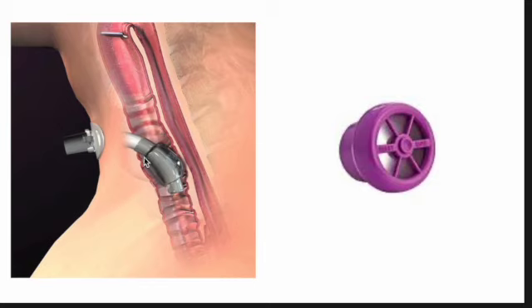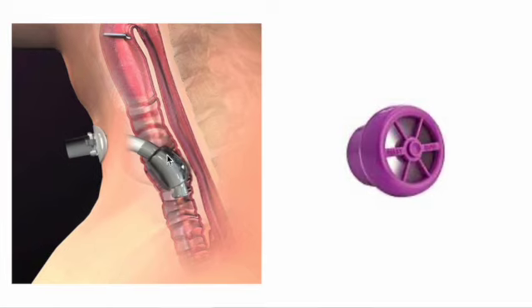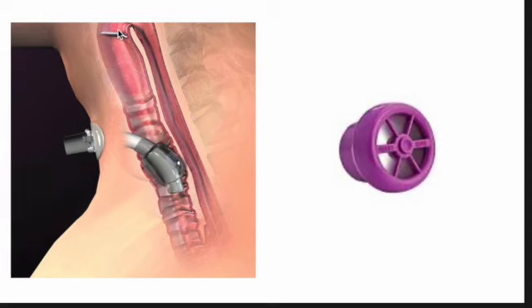What if a patient with a tracheostomy tube wants to speak? Should this balloon be inflated or deflated? Yeah, it should be deflated so that the air goes up and engages the vocal cords. So imagine that you're rounding on a patient with a tracheostomy tube, and you go to talk to them, and they're trying to talk, but they can't quite make sound. What do you think the issue is? Well, the problem is that when they're going to talk, the air is going up and it's engaging the vocal cords, but it's also getting blown out here. And there's just not enough airflow coming up the trachea and engaging the vocal cords to cause them to vibrate and create sound. So you need something to keep the air from going out of the tracheostomy tube and just going up and engaging the vocal cords. And that's this here. And this is called a Passy-Muir valve.